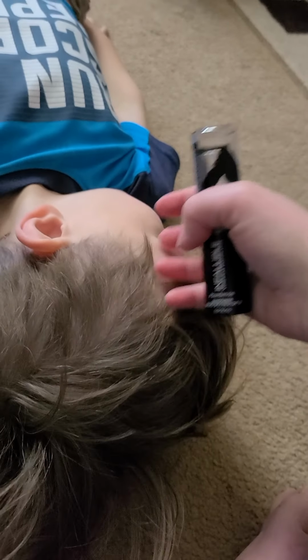Indicators for this exam would be to do a determination for if a patient is brain dead. It can be used if there's a possible vasospasm, or if there's a clot, or if the patient had a stroke and they're having problems with their eyes and vision and things like that. All of those can be indications for doing this exam.